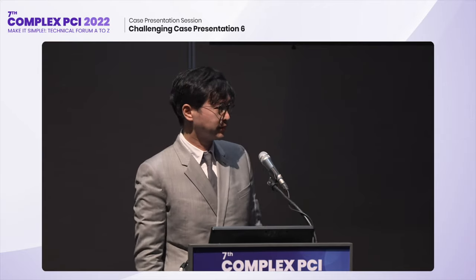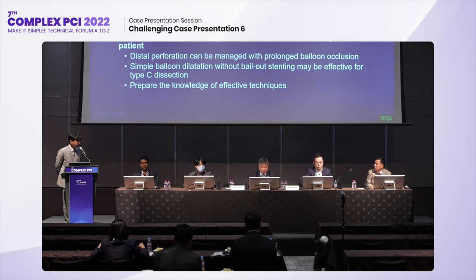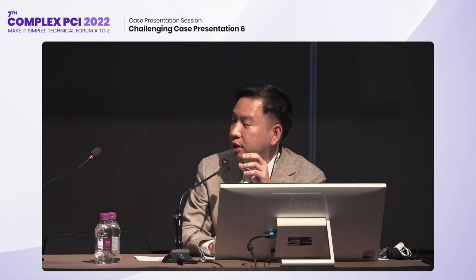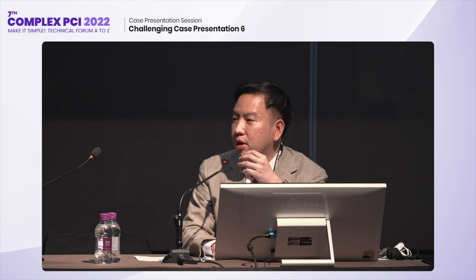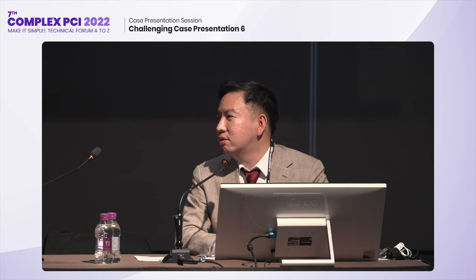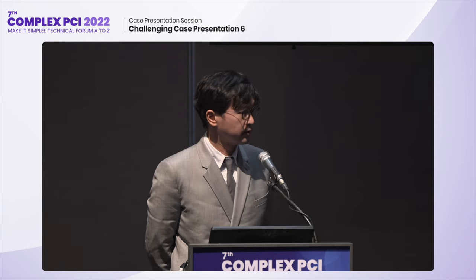Okay. Any other comments from the panel? For coronary perforation, the first thing I do is prolonged balloon dilatation. And the second thing, I rapidly do an echocardiogram to check for tamponade. And maybe after the procedure, you choose serial echocardiogram, as there may be delayed tamponade after the procedure. Yeah. We did echocardiography after the procedure, and it showed no pericardial effusion. Okay, thank you.